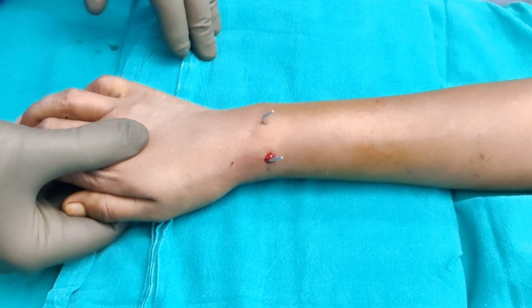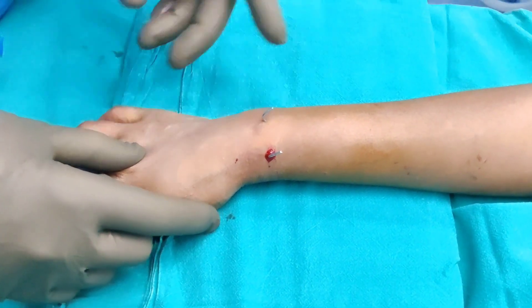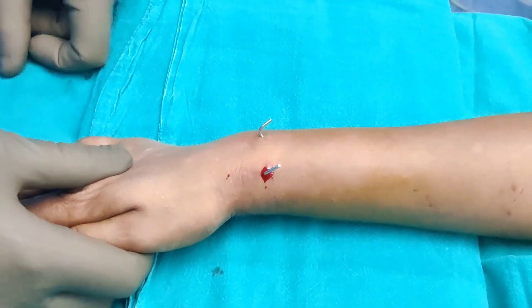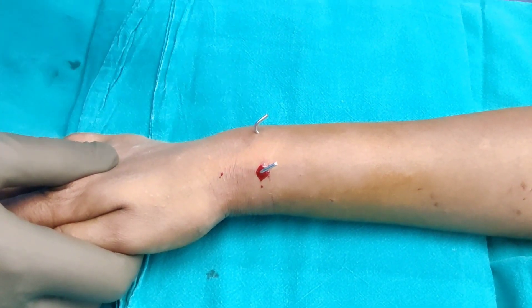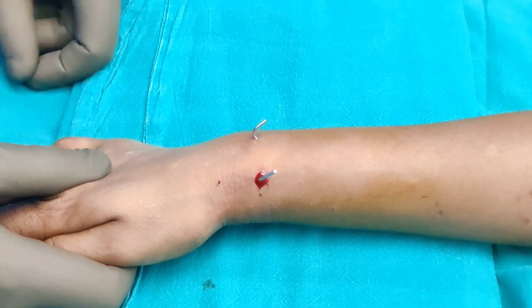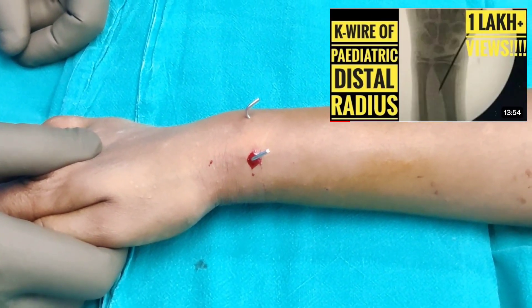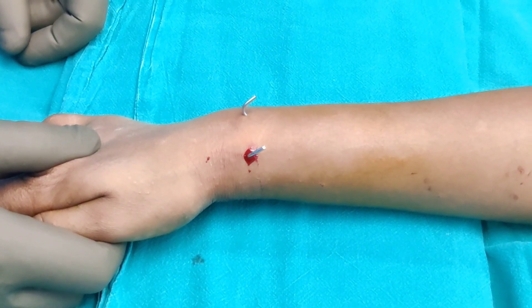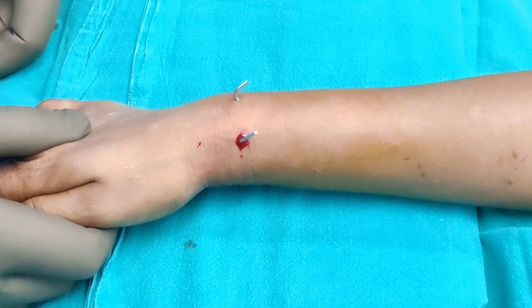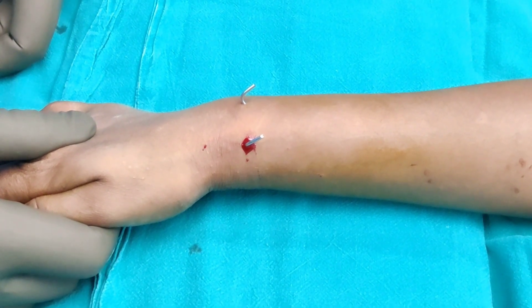We have passed two wires, one from the radial side and one from the dorsal side, avoiding the physis. If you want to learn the tricks on how to pass the wire with minimum effort — Akash took two attempts and I passed mine in a single attempt — if you know how to orient your wires you should be able to pass it in one go. We have done a dynamic screening and the hand is absolutely stable. We will keep a below-elbow plaster for a few weeks and then take the wires off at 4 weeks.